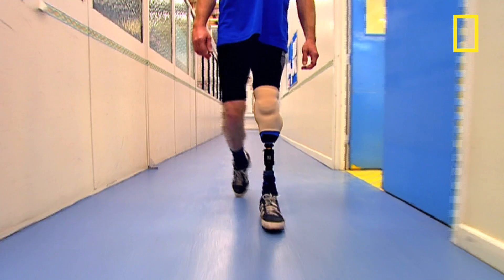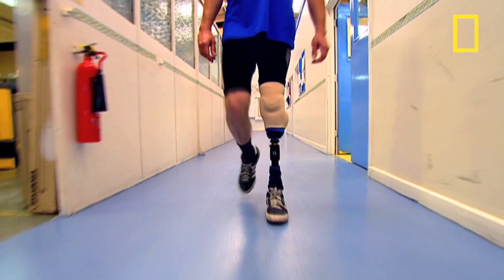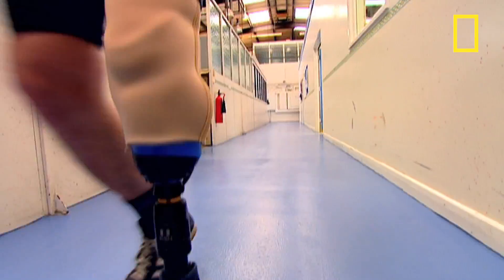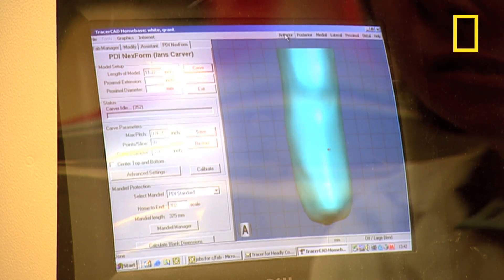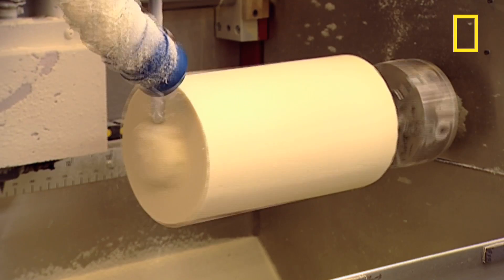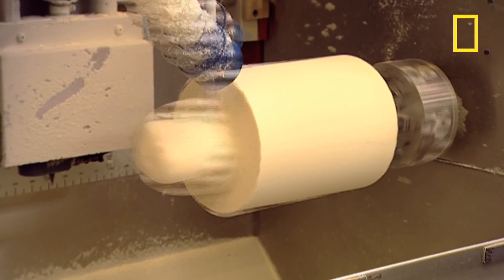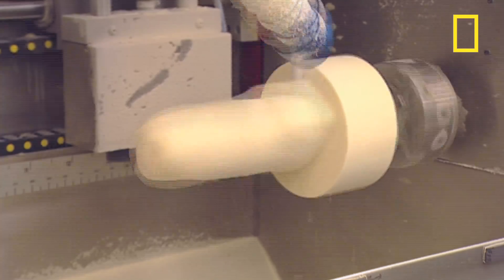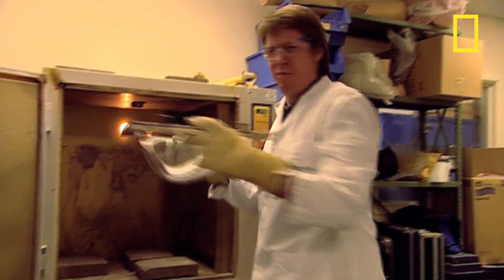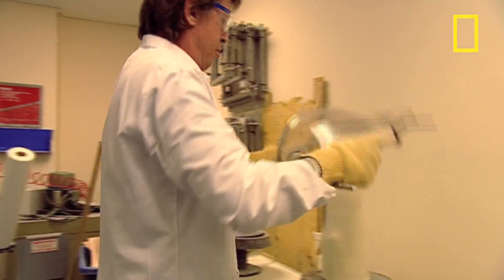Finally, the socket has to be manufactured — the bit that connects all this high-tech wizardry to the patient. The hospital simply provides a digital map of the stump from which a foam cast can be produced. A hot plastic film is then draped over it and vacuum packed against the contours.